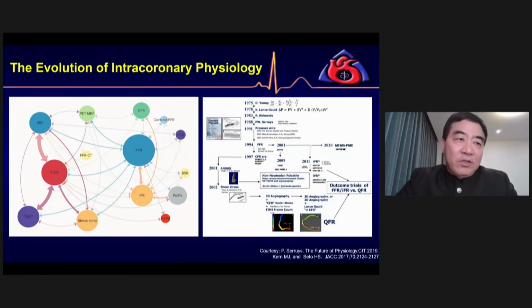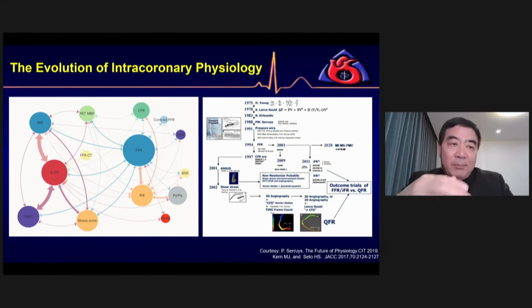Coronary physiology parameters have been widely introduced for evaluating the presence of ischemia instead of traditional QCA. I think more than 20, 30 years ago, when I learned PCI, I depended on QCA. But coronary flow reserve was measured with a catheter-mounted Doppler crystal at the tip of the catheter, measuring the coronary flow velocity, in the 1970s. And afterwards, since 1993, I think Nico Pijls and Bernard De Bruyne introduced FFR using a pressure sensor wire, instead of the Doppler crystal, what we call the pressure wire today.